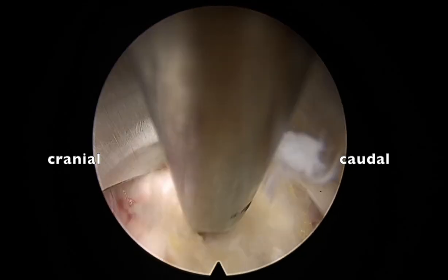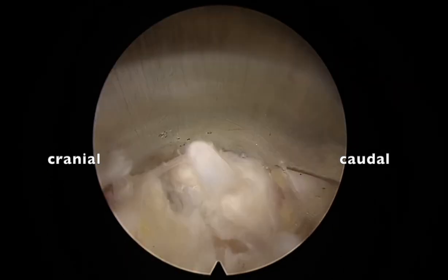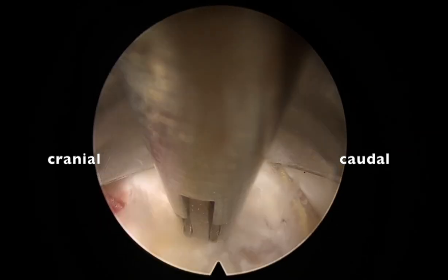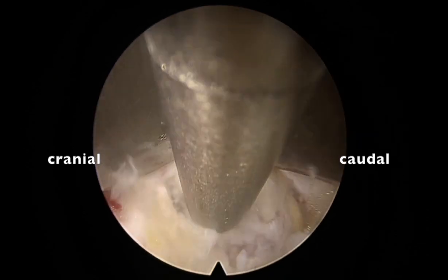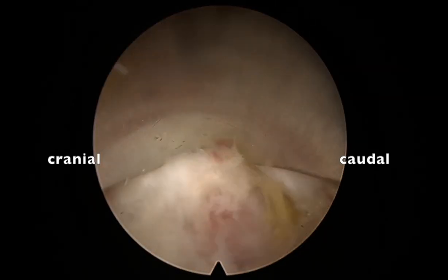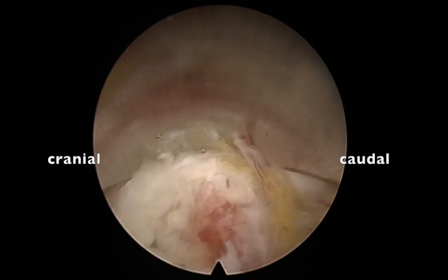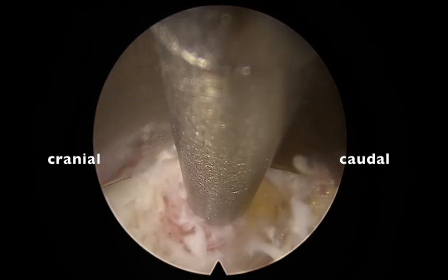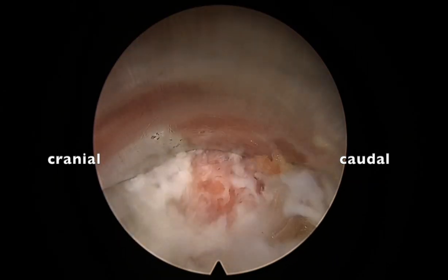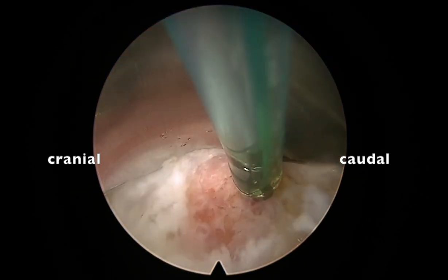Once done, I'm entering the disc space. At three o'clock there is a hard osteophyte hump. I'm trying to cut with the cutter, but since it was hard and bony, I use a 2.5mm mill to flatten it out. You can see I'm just flattening the hump at the body of L4-L5. Once it is flattened, hemostasis is attained and the remaining fibrous hump is removed.